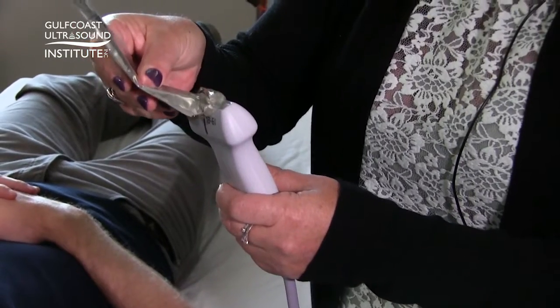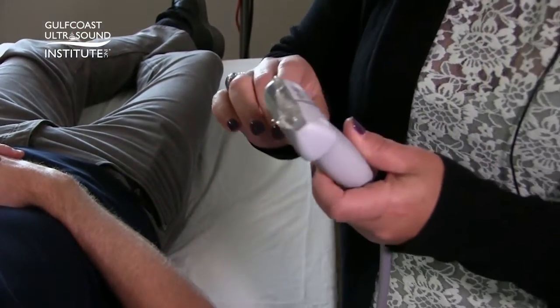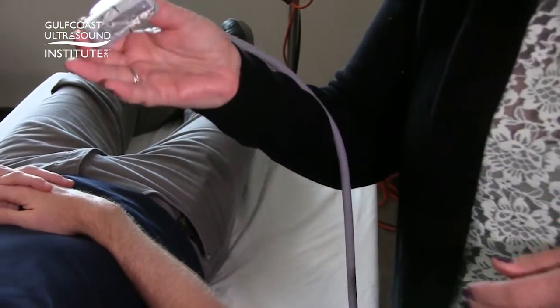To perform the ultrasound, you have a few options: you can put the gel on the closed eyelids, or put the gel on the transducer itself. Alternatively, you can place a Tegaderm over the eyelid, but be careful — you risk pulling out eyelashes when you remove it, which patients are not necessarily a fan of.